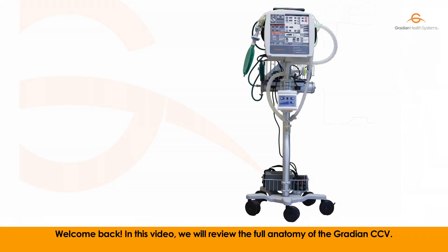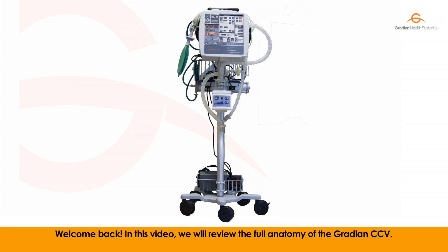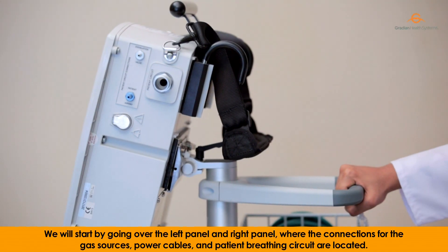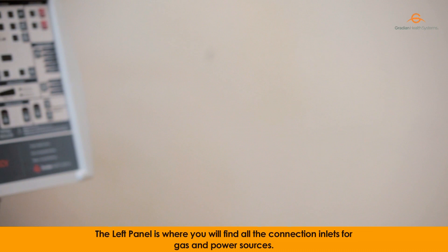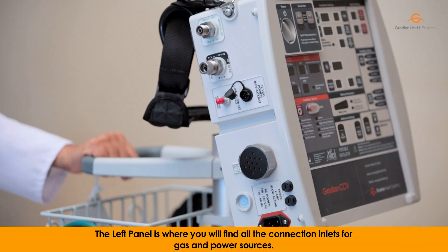Welcome back. In this video we will review the full anatomy of the Gradient CCV. We will start by going over the left panel and right panel, where the connections for the gas sources, power cables, and patient breathing circuits are located. The left panel is where you will find all the connection inlets for gas and power sources.